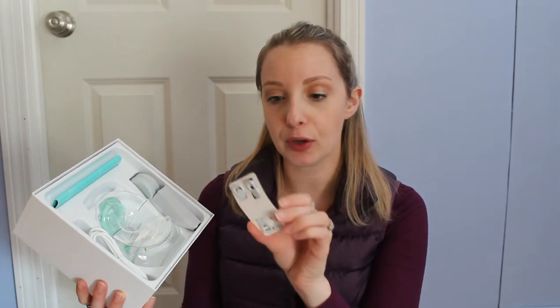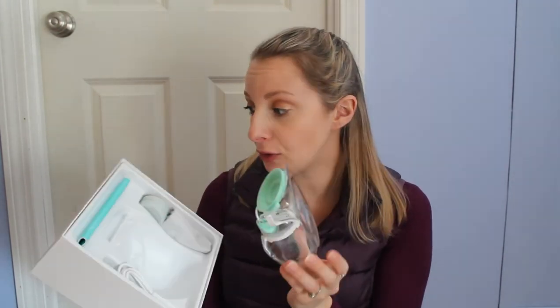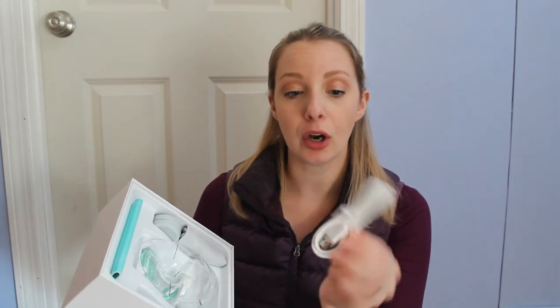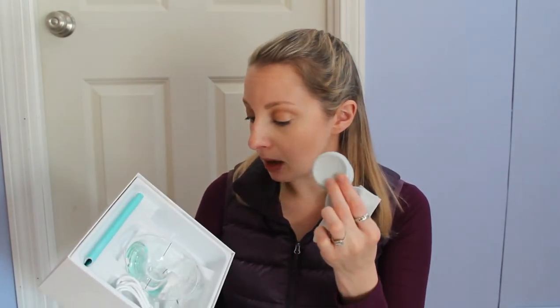This looks like an extender for your bra — love that. And this looks like it is just a whole other piece, so you technically do have two; you just don't have another hub. So if for any reason you need one, you could probably find a hub on Facebook Marketplace or a yard sale. This looks like just a normal USB cord to charge it. And there are some bottle caps for the collection container.